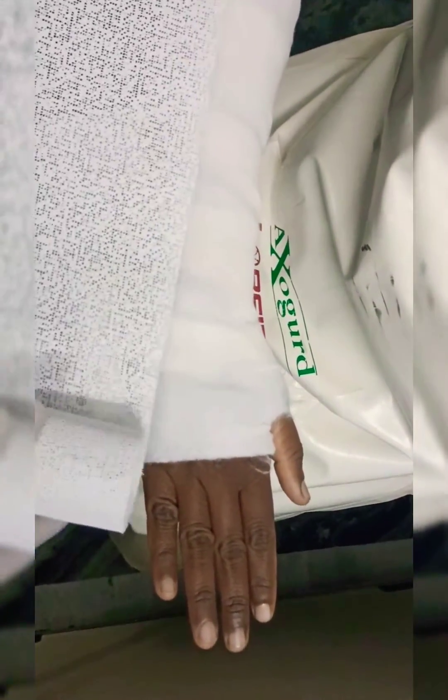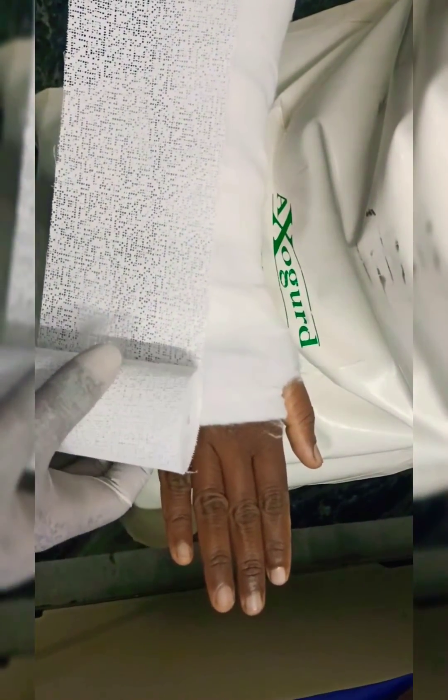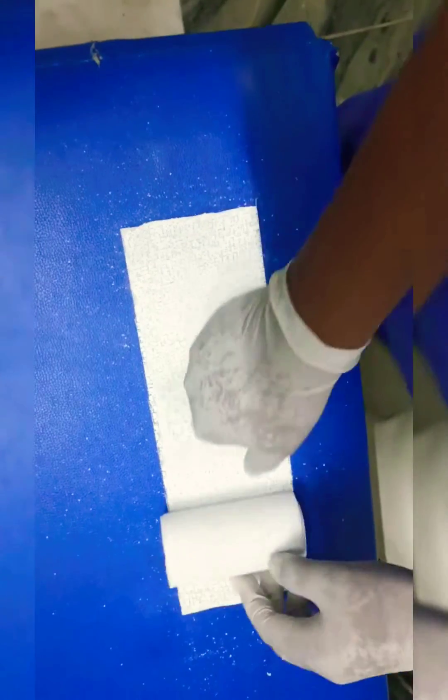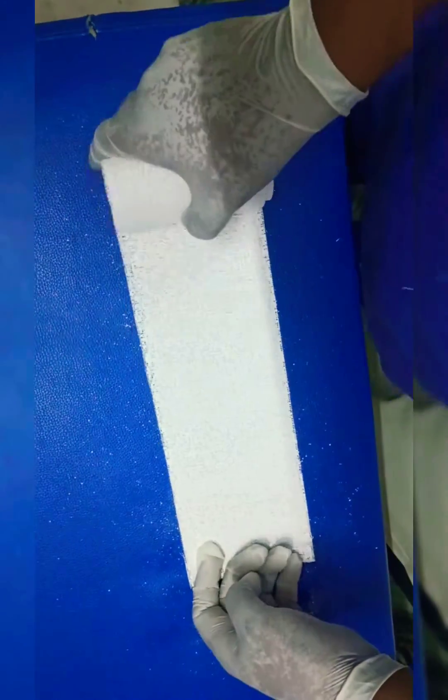Measure the forearm size and prepare POP accordingly. With the measurement, make 6 to 8 layers of POP.